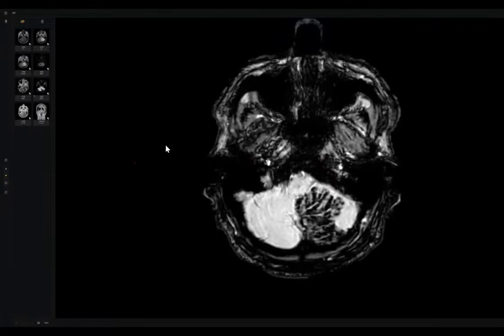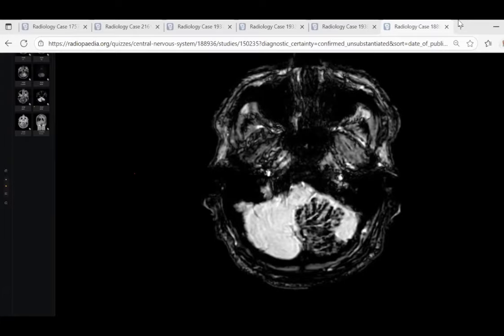But it presented in the CT looking like a space occupying lesion. All of us must read today about the treatment of stroke and infarction, either by thrombolytic therapy, thrombectomy, or about the perfusion. Very basic and very important information.